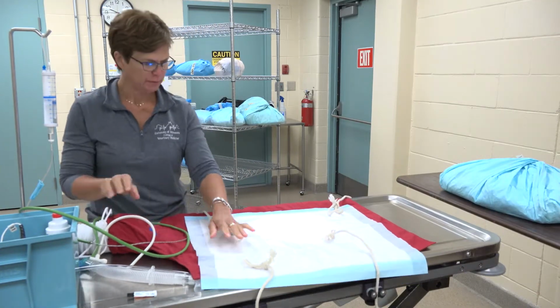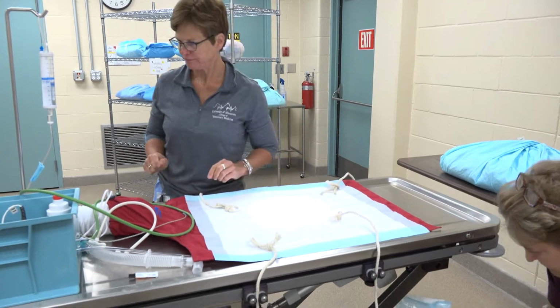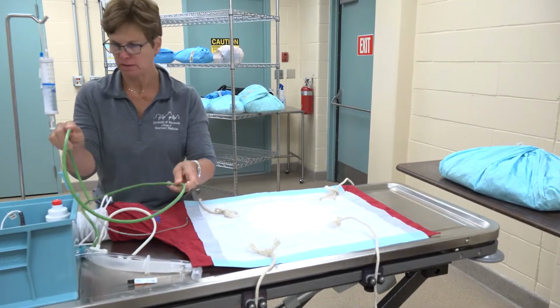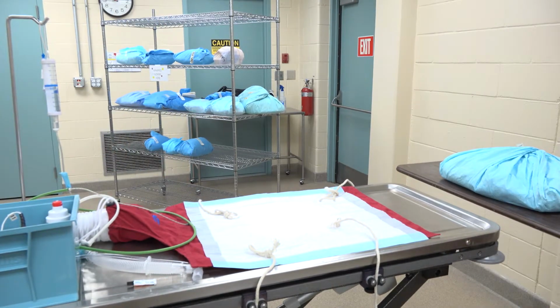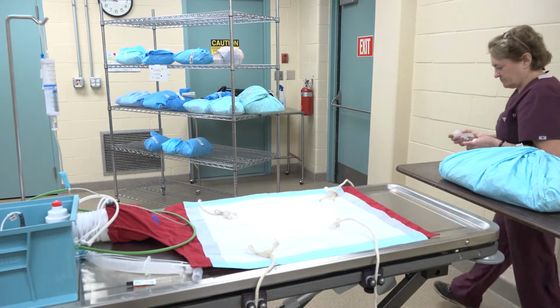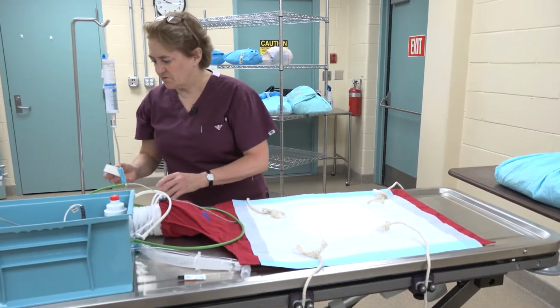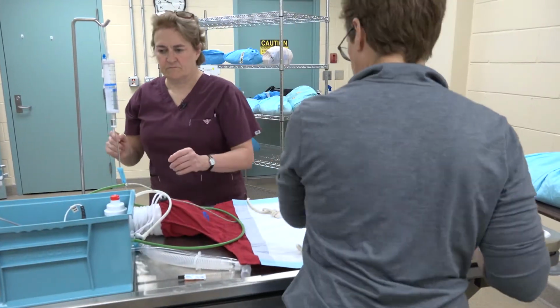Okay. We've got the potty pad that will move down after you scrub. Now, fluids will be here. Esophageal stethoscope on the scrub. Sally, here's your lube, thermometer cover, and tape. Great. And here's the scrub for patient.